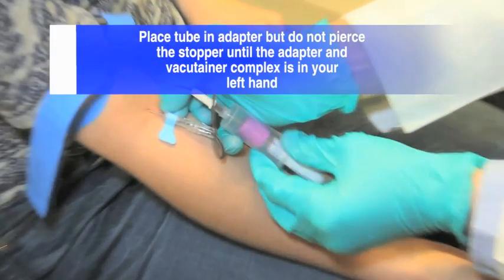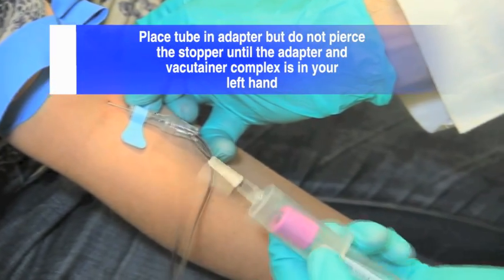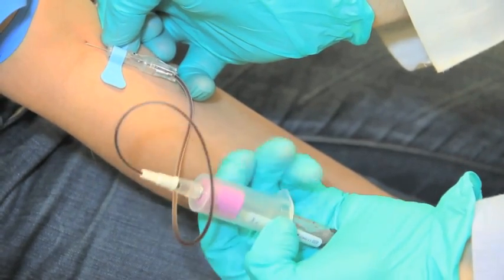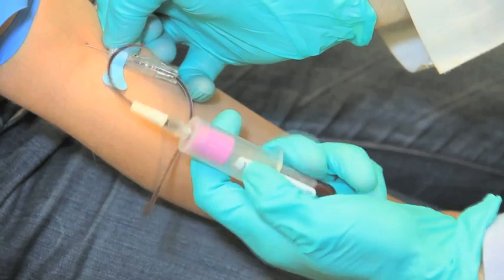Place the next vacutainer gently in the adapter, but do not pierce the seal yet. Doing so requires force and will dislodge the needle from the vein. Instead, grasp the loose adapter and vacutainer complex in your left hand and pierce the stopper to fill the tube. Repeat these steps for the remaining vacutainers that need to be filled.